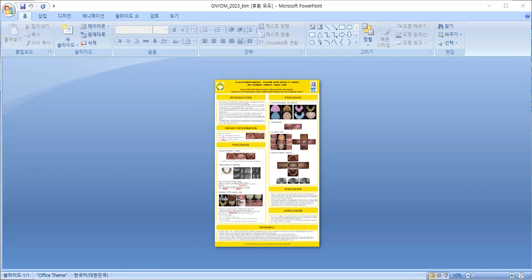In this case, bilateral posterior extension partial denture was fabricated using implant-surveyed crown as abutments by placing implants in the premolar area opposite to the residual tooth unilaterally in the mandible.